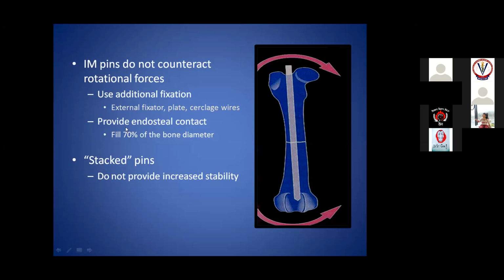Or we can use another procedure called stacked pinning. Stacking is putting something in the medullary canal. What are you stacking?